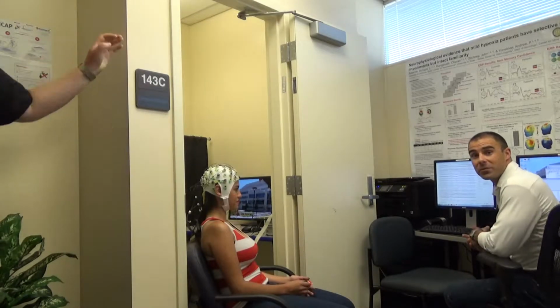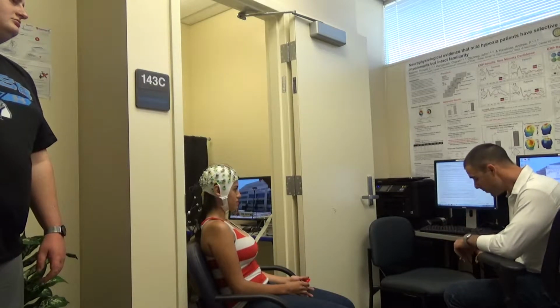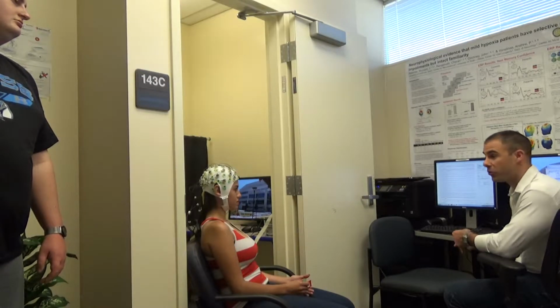Now what we want to do is have very clean data because we want good data in so that we can have good data out that we analyze. If we get some crappy data, we can manage that, right? We've talked about artifact correction, some artifact rejection, but of course we want to start with good things and not have to clean up bad things. Garbage in, garbage out, perfect saying, right?